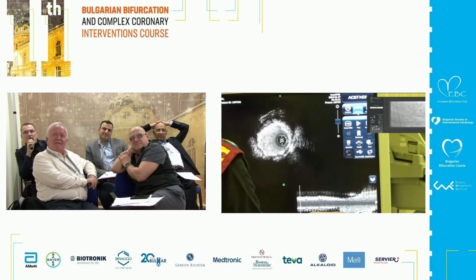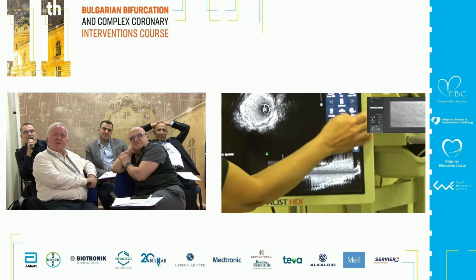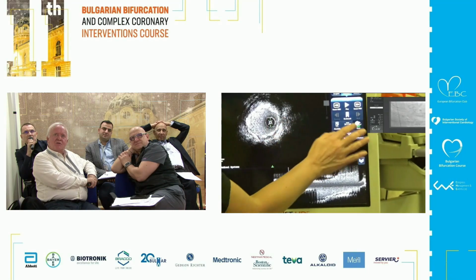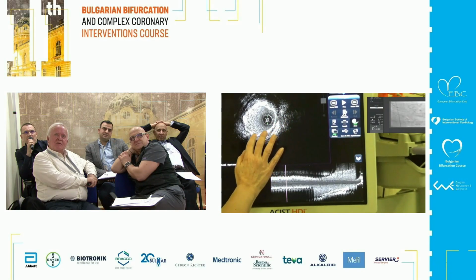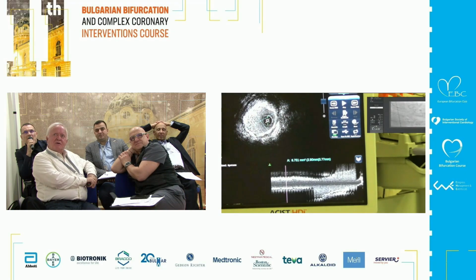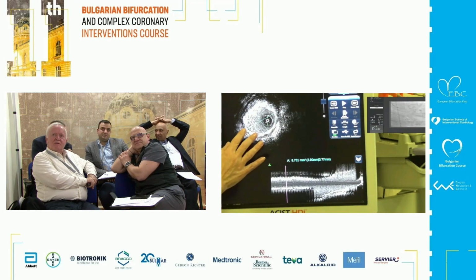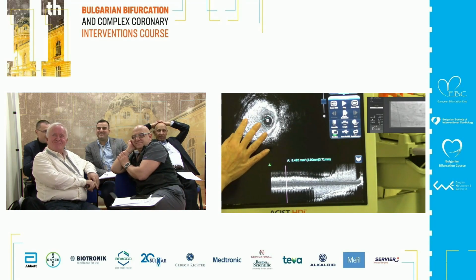Okay. Good. Here, Eva, this is okay. Okay. Almost. Yes, 8.7 as I predicted it, around 8. More than enough. More than enough.